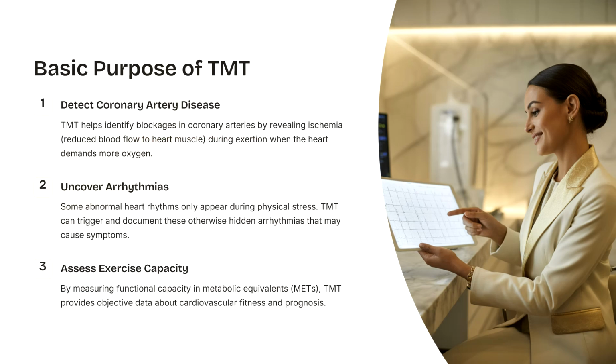That means if there is any blockage in the coronary artery, it will be identified by the TMT. How will it identify? By revealing ischemia. That means the blood flow to the heart muscle will be reduced, so the heart may not work for a long period of time and it will surrender. So it helps to detect coronary artery disease.